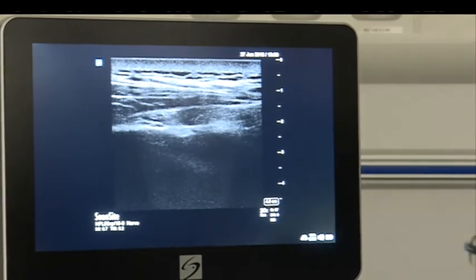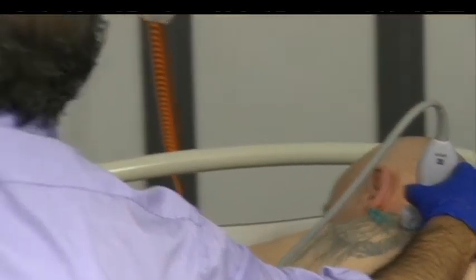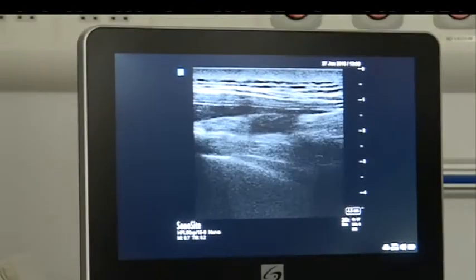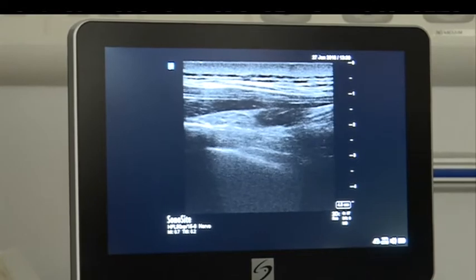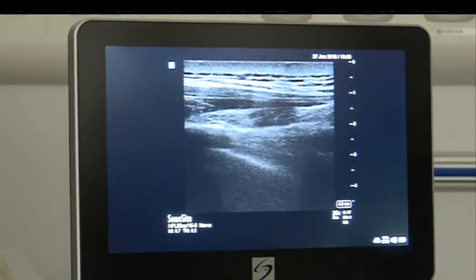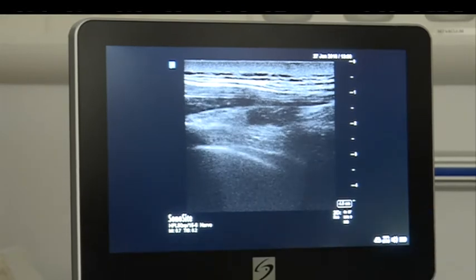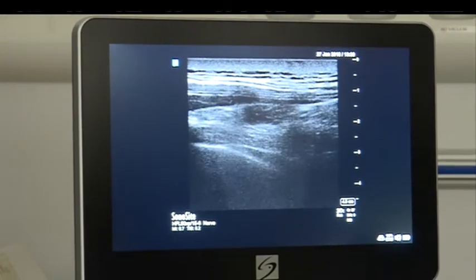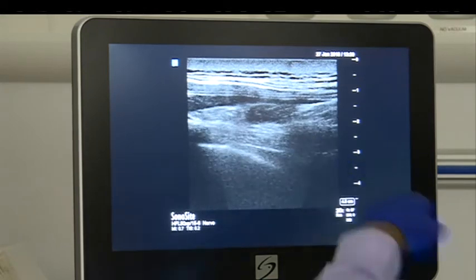Then slide your probe down — now comes into visibility your pleura. You might have to manipulate the probe a bit longitudinally. You can see above the pleura there is a thin white line — that is your intercostal membrane, the costo-transverse ligament. That is the shadow of the transverse process.